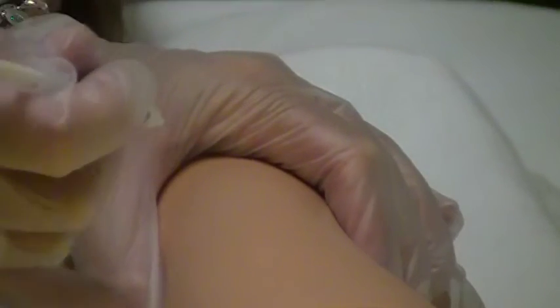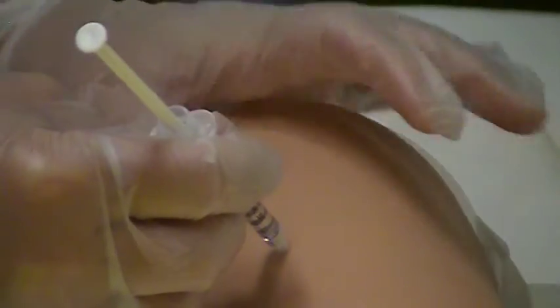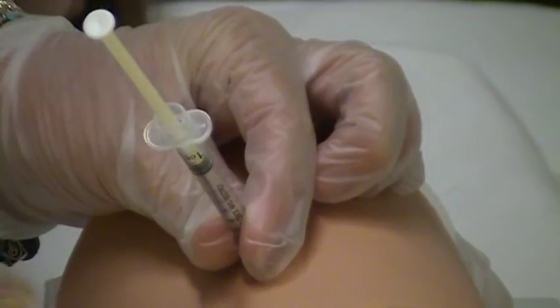We're going to clean the site with alcohol and let it air dry. We do not blow, we do not fan — we let it dry by itself. After the alcohol is dried, we take the cap off the medication and pinch the skin. Depending on the size of the patient, we determine the angle. If the patient is obese, we use a 90-degree angle straight in. If they are less than obese, we go at a 45-degree angle. Our patient is not obese, so we go at 45 degrees — pinch, puncture the skin, then move our hands to stabilize the syringe.